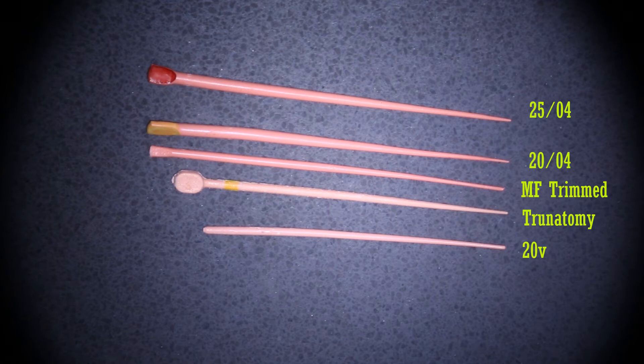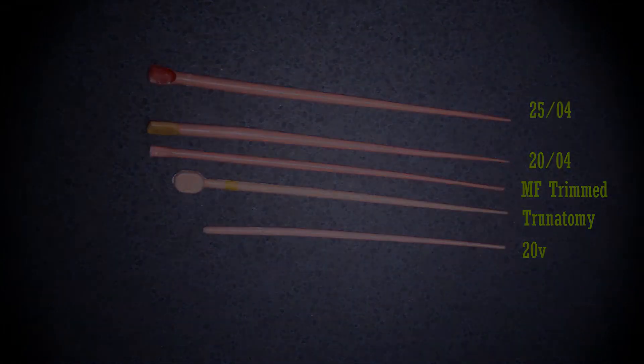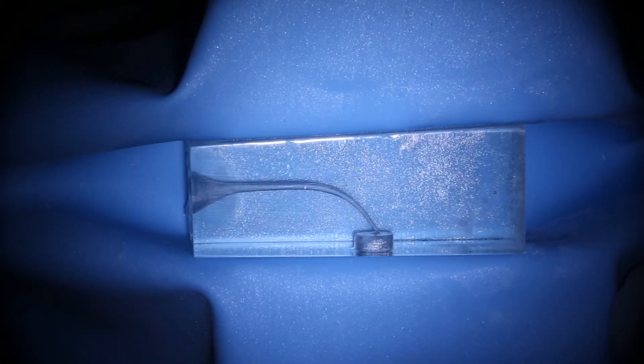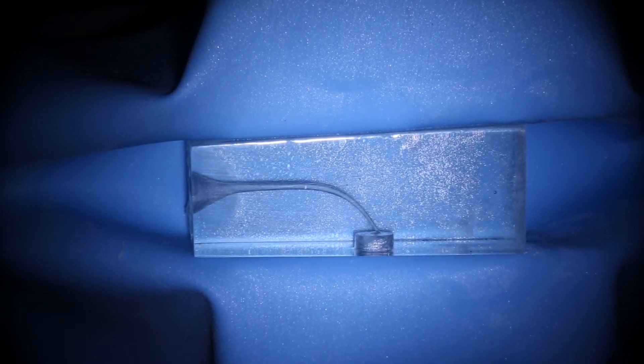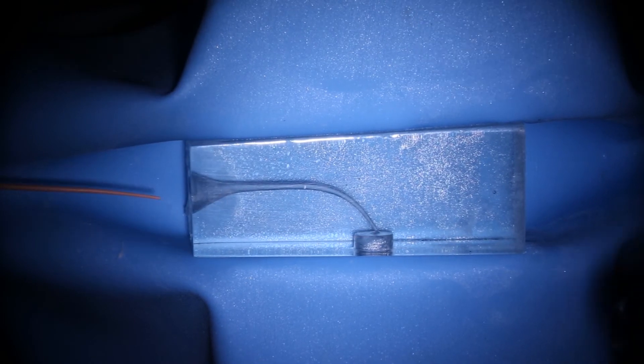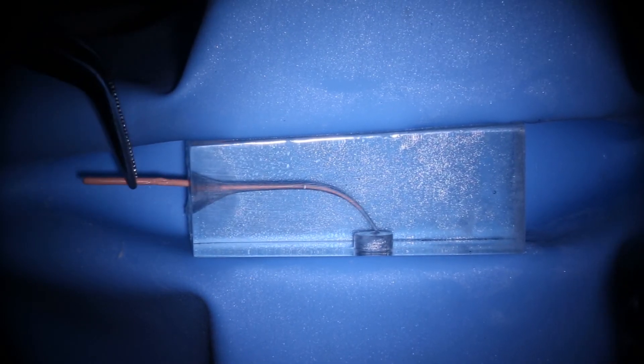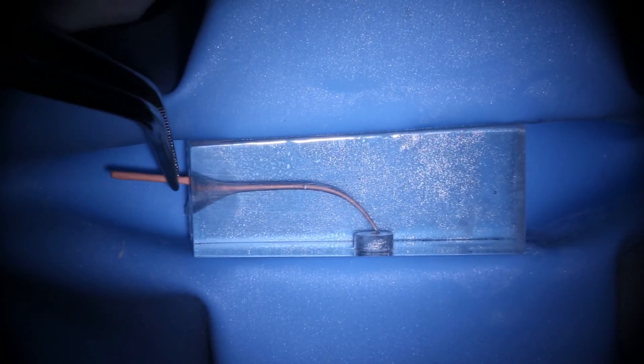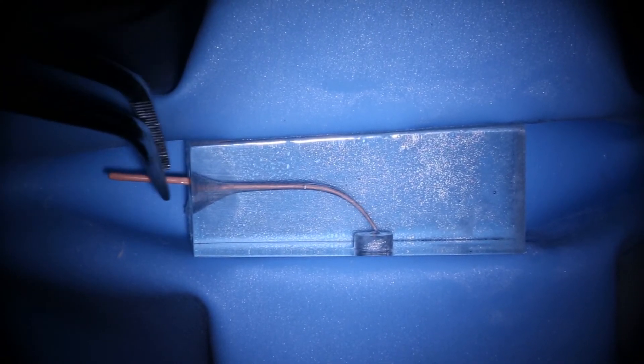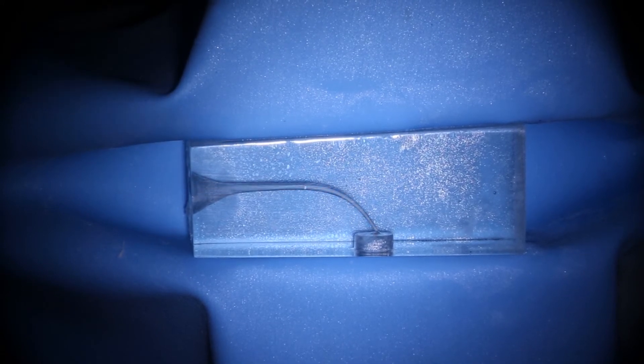So now I'll run through the obturation just for example, so you can appreciate the differences between a trimmed medium fine cone, a TrueNatomy cone or a 4% tapered cone as an option for obturation. So now we can have a go at fitting our cones. So this cone here, the 20V cone that we would otherwise previously use, but unfortunately now becoming unavailable. And again, we see that seated fitting, that's good.